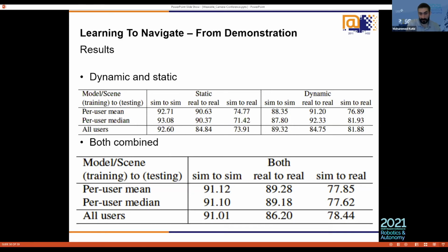But this was another interesting thing to look at, because given this data, if it was to train on simulation, it would be much easier and more efficient. Simulation could be distributed worldwide over the internet. We can get tons of data, unlike if we have to put people on wheelchairs, ask them to drive around, so we learn from their experiences.